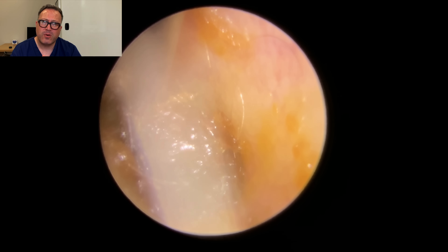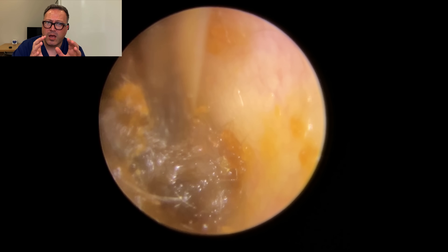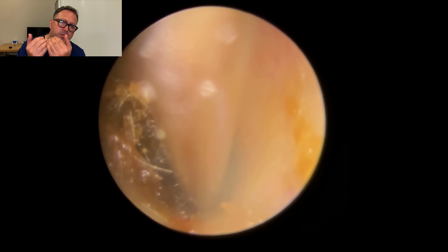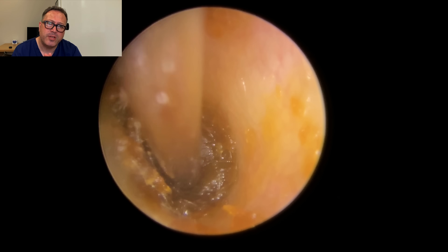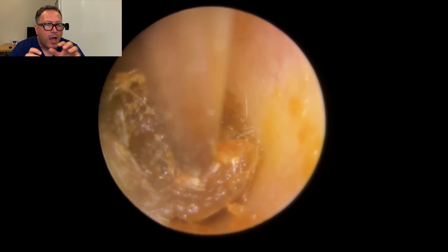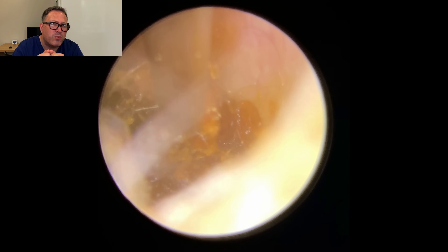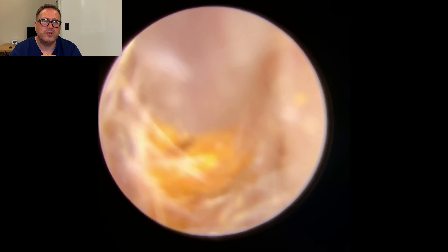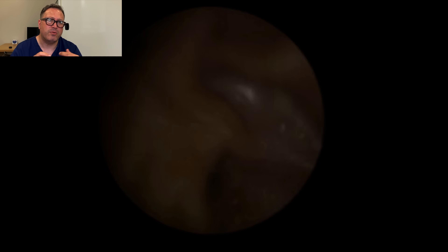Trying to get a grip on this next section — we've got to be a little bit more careful here. It's very deep and the whole thing is moving as one big piece. So I'm trying to fold down the canal, which effectively draws the wax away from the eardrum — it kind of folds it forwards, which is a lot more comfortable for the patient. You can see as we get a grip on the edge how the whole thing turns. Holding that section now in the center flatter section, allowing the pressure to build to help us hold it tight enough just to bring it forwards and away from that drum. There we are — folding this down now. As we pull this out, you can see it just jams on the outer part of the ear canal as it tries to pull the remaining section through. That's a nice big chunk gone.